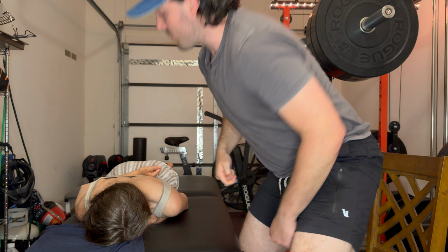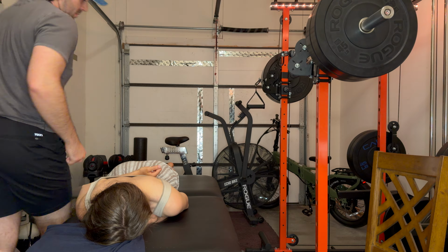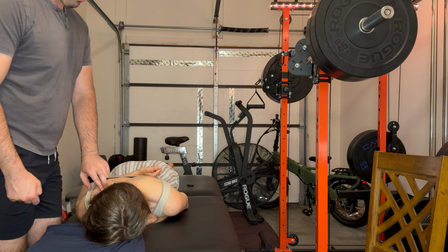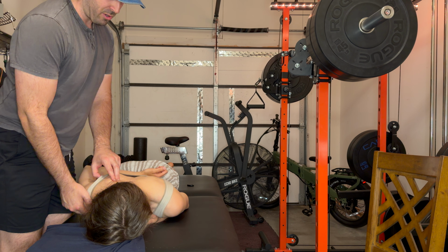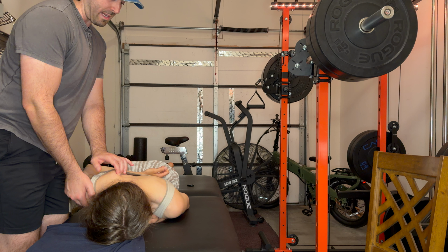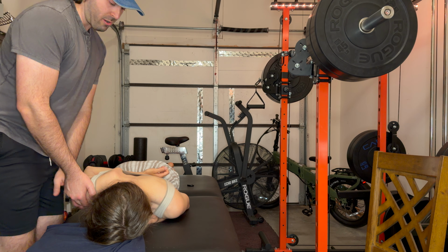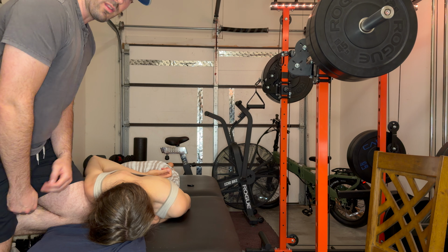But what I'd like to do is stand on the same side as the person. From here, again, I'm finding that same superior medial border of the scapula. I might even lock them into a little bit more internal rotation, that way that superior medial border will flare a little more. So for some patients, you can see that the medial border is well exposed and I can really pick up on it. The levator scapula actually lies on the superior medial border here. I would put a little towel roll or something underneath the person. In some cases, I can even get creative and just use my knee to help support the patient as well.